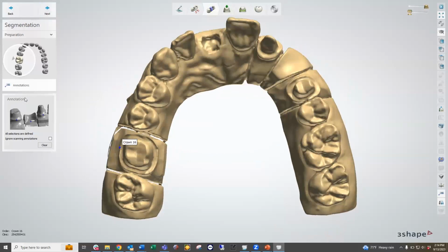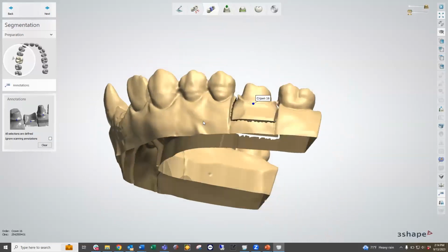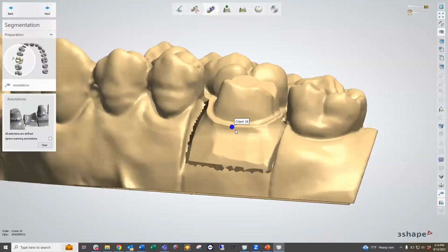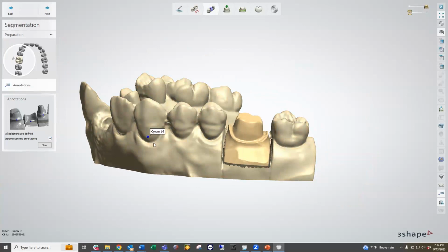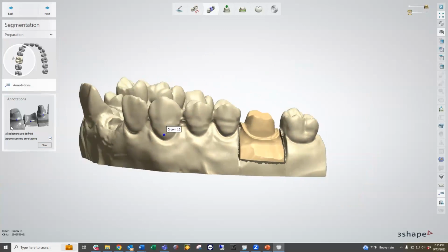But if we wanted to, we can take a look at our annotations. The annotation is just this dot that we see on here. This dot has been placed during the scanning process, and it helps to identify the difference between the die versus the rest of the model. At this point, we can ignore the scanning annotations and choose whatever we want to be the die. So if I wanted, it could be over here. But you notice that the model turns a different color from this segmented area. That's because it's choosing this to be the area that we're going to be placing our crown on versus this separate scan that is segmented from this lower quality scan here. So you can see the difference between the two different colors. That's how we can identify whether or not we've selected the correct annotation on the unit versus the rest of the model that we're working with.